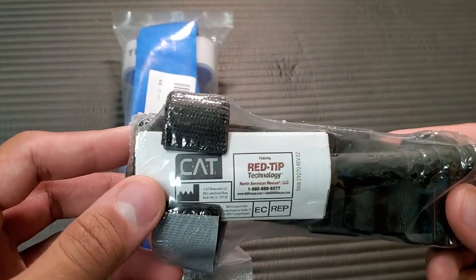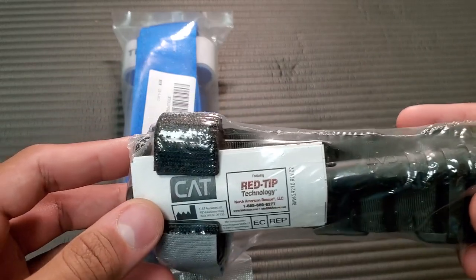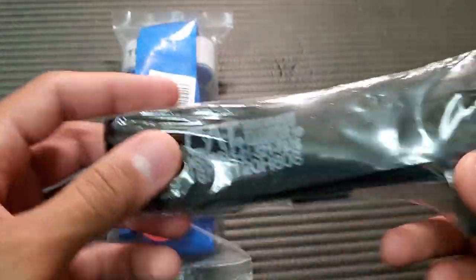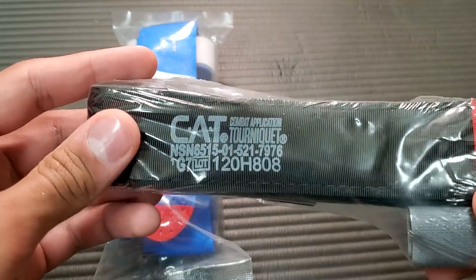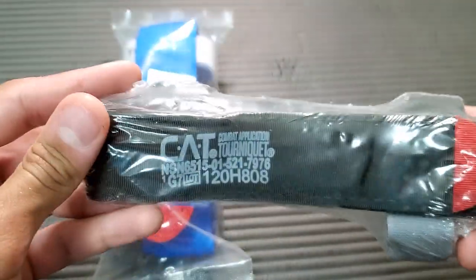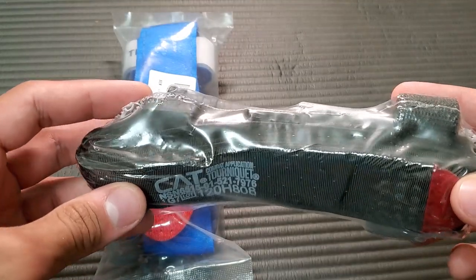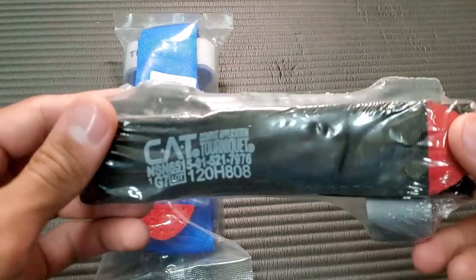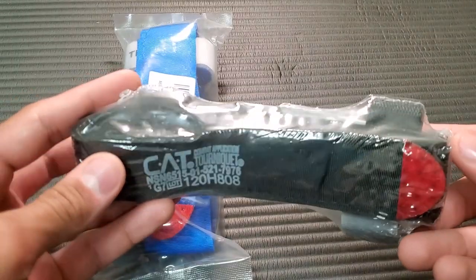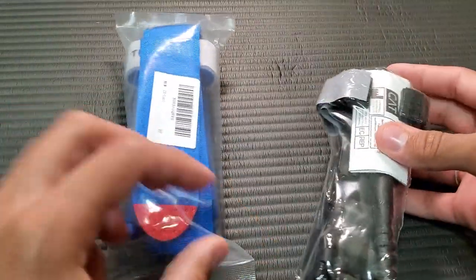Here we have the CAT. You can see it's got a little leaflet with instructions and some information about it. On the CAT itself, it's got the lot number and everything. They usually have an expiration date on these CATs. A lot of people will end up using these past their expiration, but it's just something to consider.